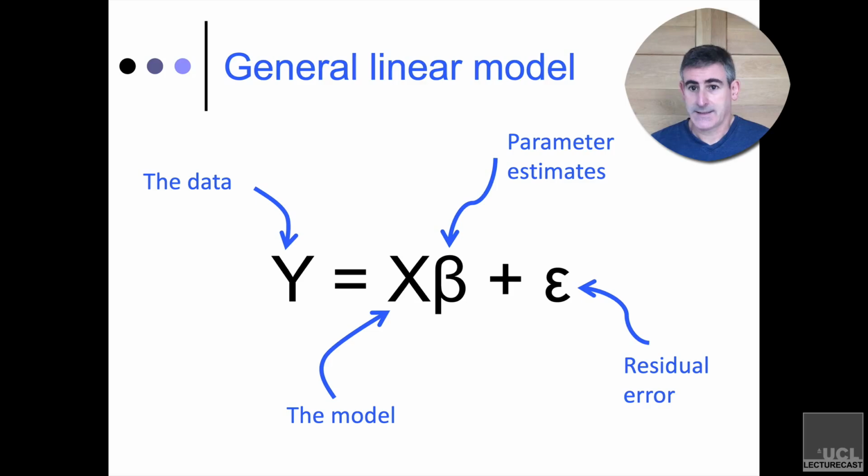If we had, say, a second term to go through more complicated fMRI analyses, fMRI designs, then we could go into other techniques. So there are things like independent component analyses that can be used to look at your fMRI data. There are what are known as multivoxel pattern analysis methods, which are essentially machine learning kinds of approaches. And there are others. There are wavelet analyses. There's a whole slew of these. And they're all valuable and they all play a role.